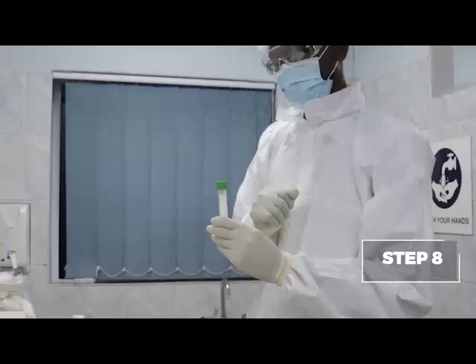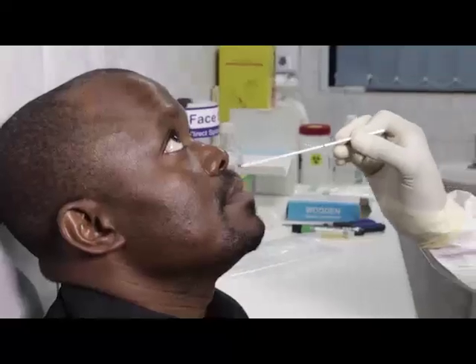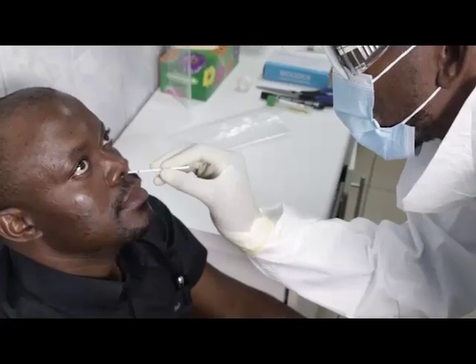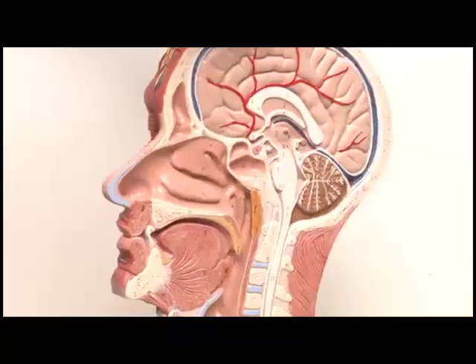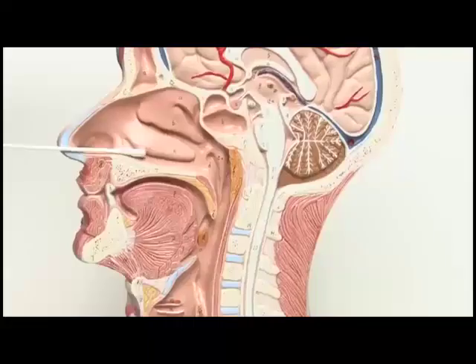Step eight, remove the nasopharyngeal swab from its packaging and insert it into the nose, parallel to the floor of the palate, not upwards, until resistance is encountered or the distance is equivalent to that from the ear to the nostril of the patient, indicating contact with the nasopharynx.